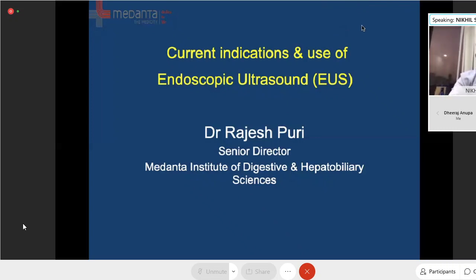Thank you, Dr. Mahesh Goenka, sir, and thank you, DNB, for giving this opportunity, my dear friends, Dr. Sonthalia. I know that today we have DNB students, and I thought that I'm going to talk briefly about the current indications and uses of endoscopic ultrasound in GI practice. It's a huge topic, so I'm going to just touch upon what the indications are, when you should subject the patient to endoscopic ultrasound.